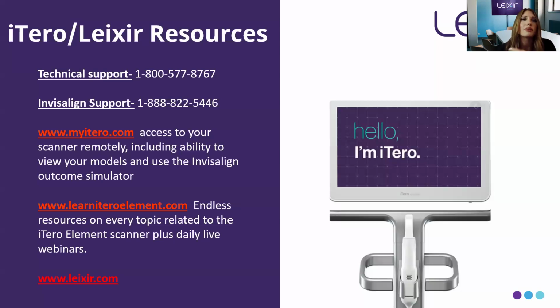So technical support, Invisalign support, myitero.com, to access your portal, to add those attachments and view your cases if you're not familiar. If you don't use myitero.com, highly recommend doing so, especially scan evaluations with patients as well. If you're doing wellness scans in your practice, it makes it a lot easier, and then you can move the scanner out of the room and on to the next, but still be able to view those scans.